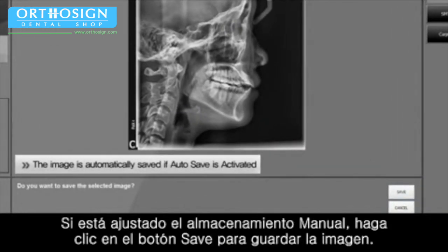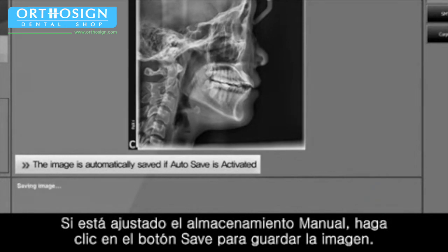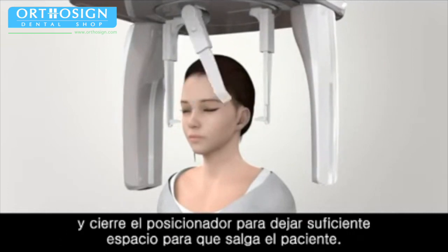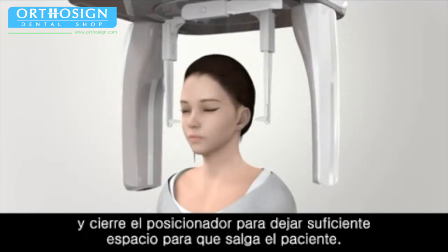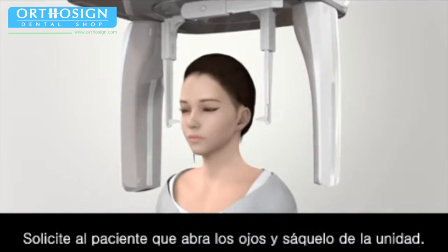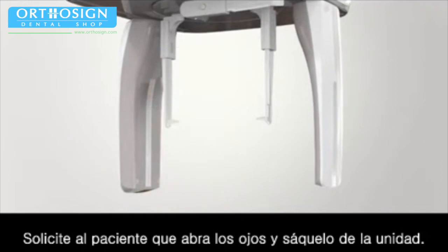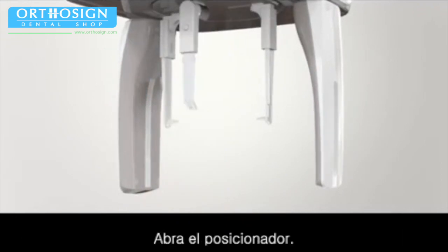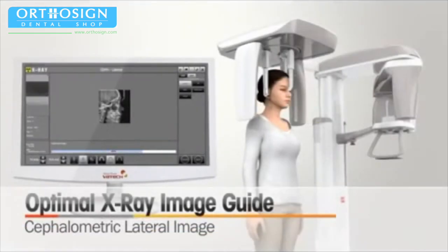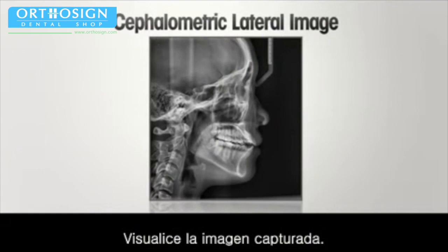If manual save is set, click the save button to save the image. Open the ear rod and the nasal positioner and fold the positioner to make enough space for the patient to go out. Ask the patient to open their eyes and guide the patient out from the unit. Then unfold the positioner down and check the captured image.